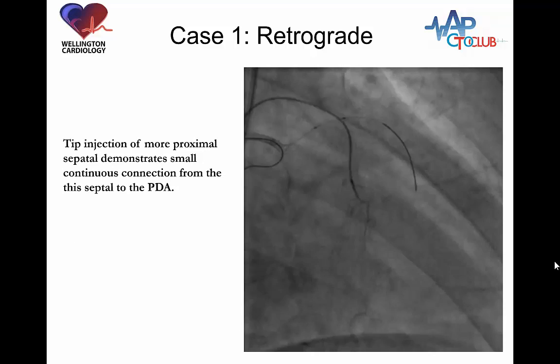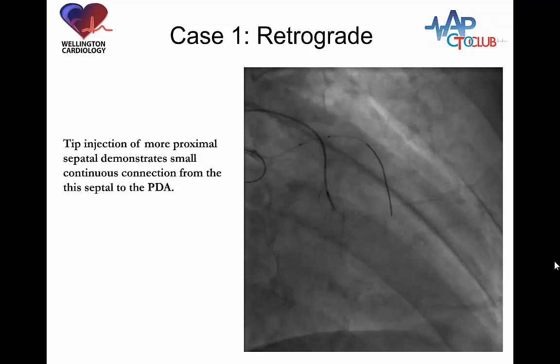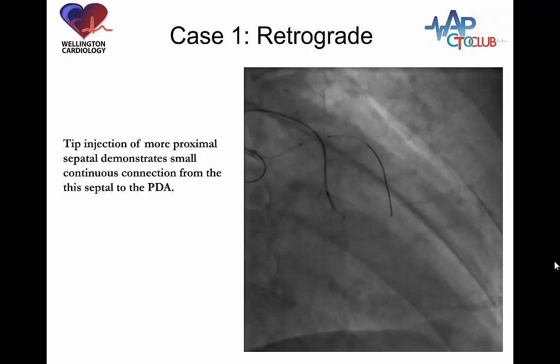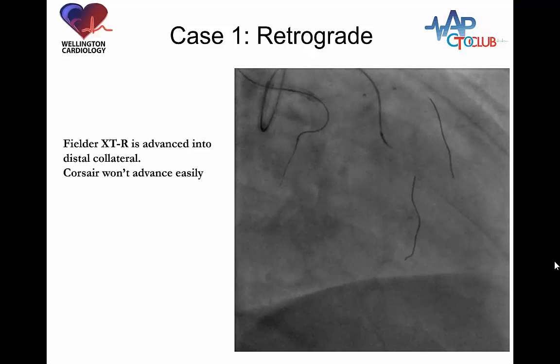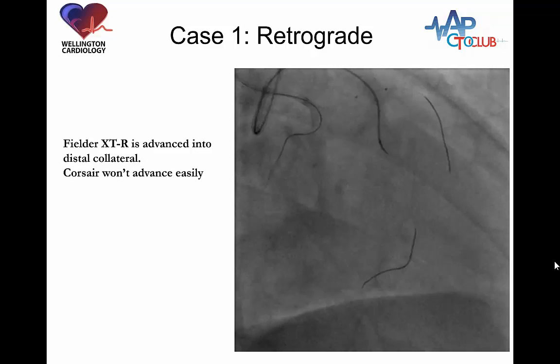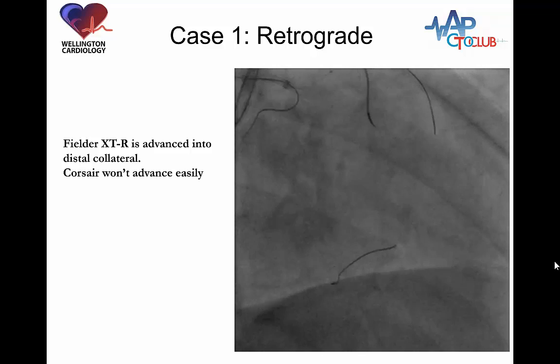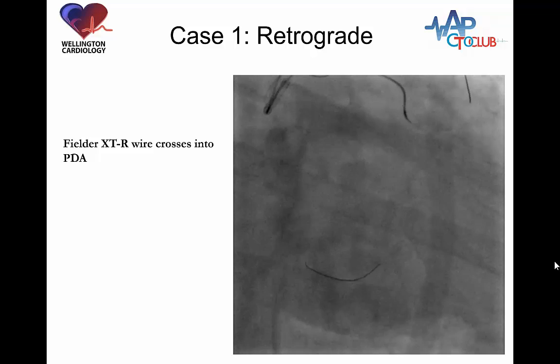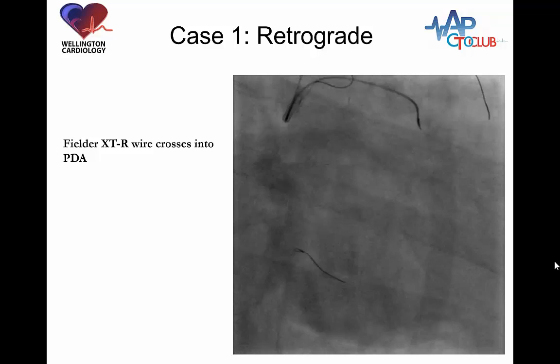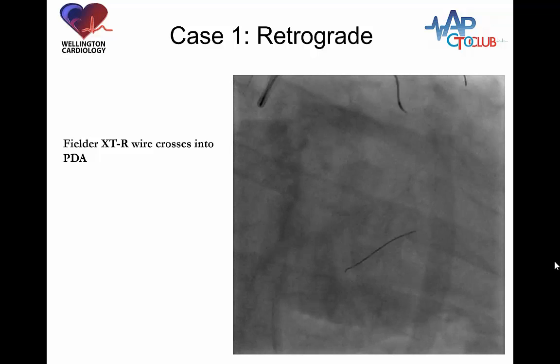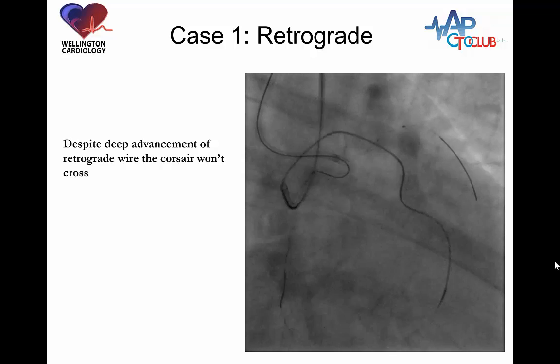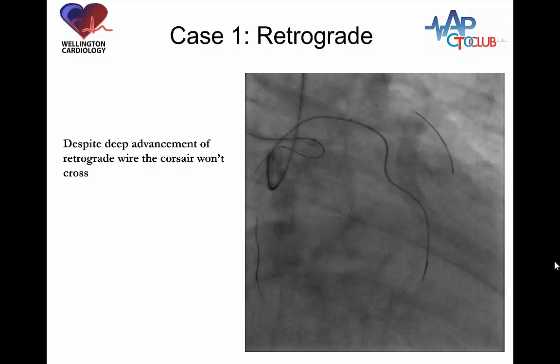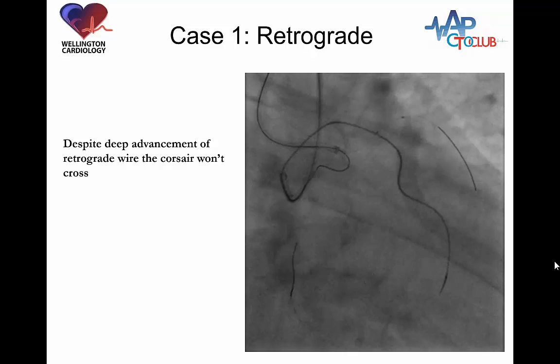This is the first septal, and on the selective tip injection, just above the tip of the catheter there is a promising-looking branch which was invisible on the non-selective injection. This was initially wired with a Sion wire, then converted to an XTR wire, making good progress down to the distal vessel. The wire was extended further into the distal vessel, and a retrograde injection confirmed the location. The wire advanced up to the mid vessel, but the problem was we couldn't advance the Corsair catheter because the microchannel tracked is very small.